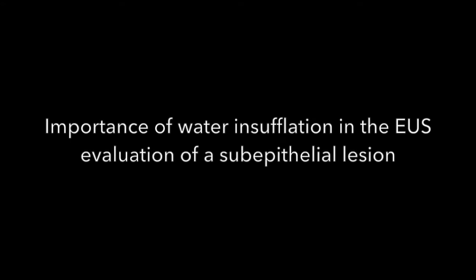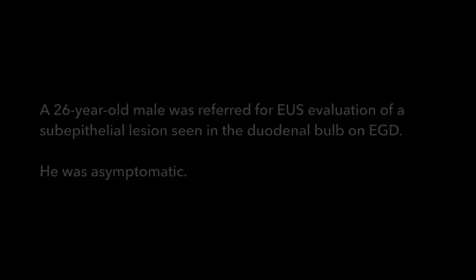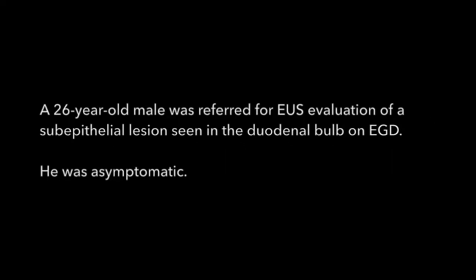In this video, we'll be demonstrating the importance of water insufflation in the EUS evaluation of a subepithelial lesion. A 26-year-old asymptomatic male was referred for EUS evaluation of a subepithelial lesion seen in the duodenal bulb on EGD.